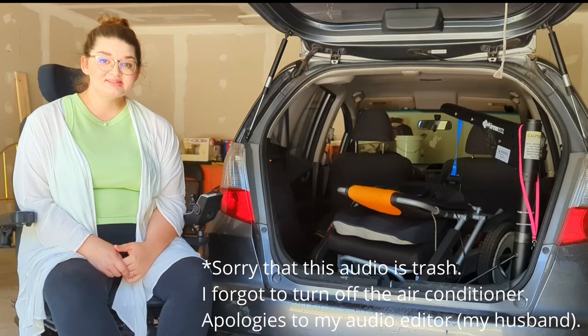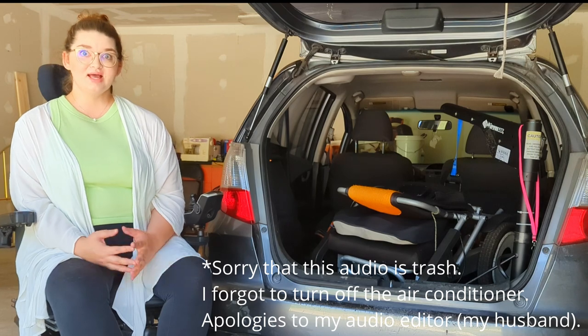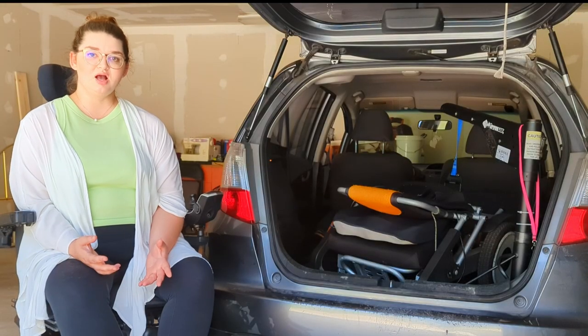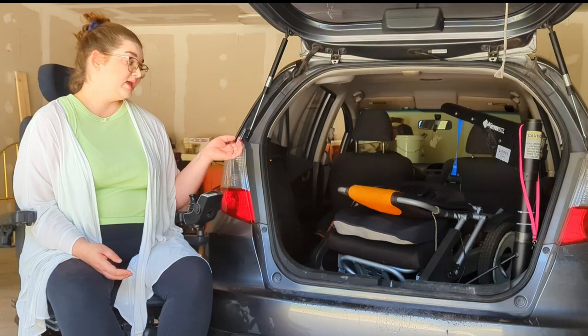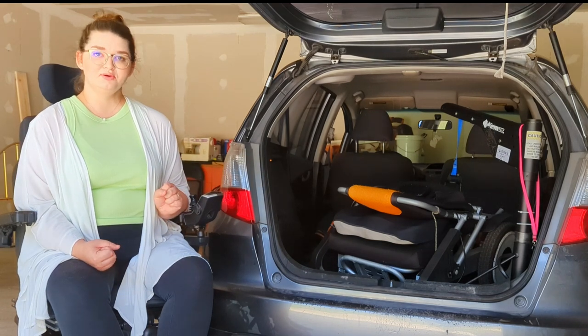Hi friends! Welcome back to Disabled in Nature, where we talk about all things disabled in nature and sometimes we even go outside. Today we're kind of outside, I guess. We're in my garage and I'm going to give you a tour of my travel power wheelchair. First I'm going to show you how I get it in and out of the car, and then we'll take a little tour of its components.